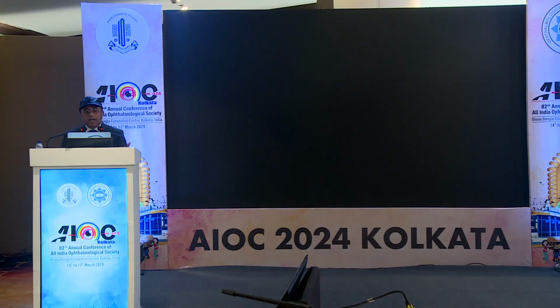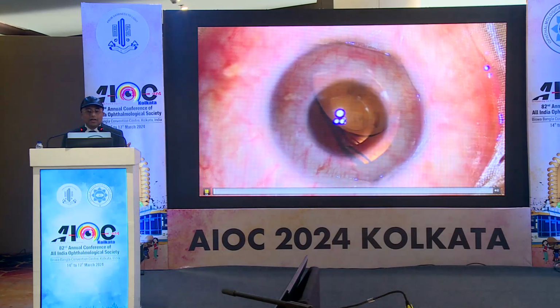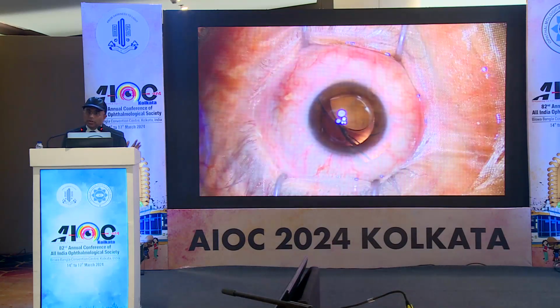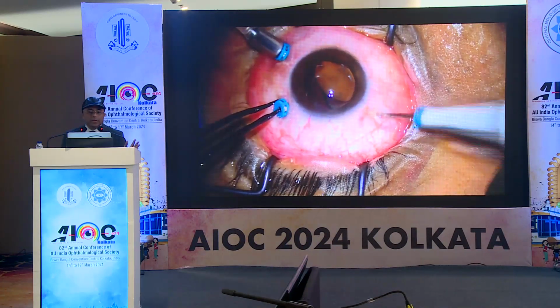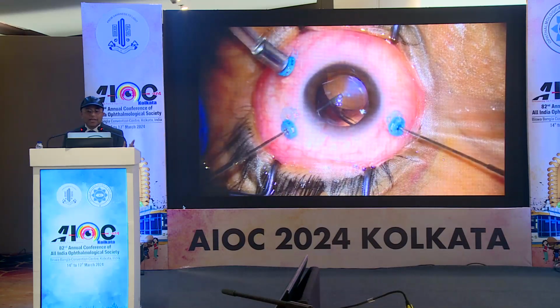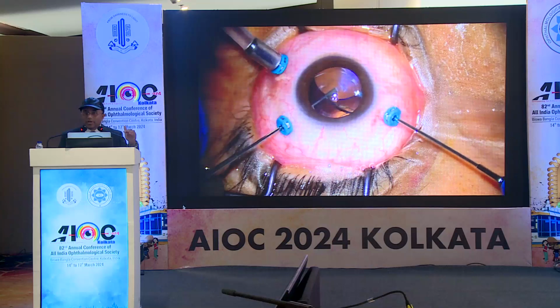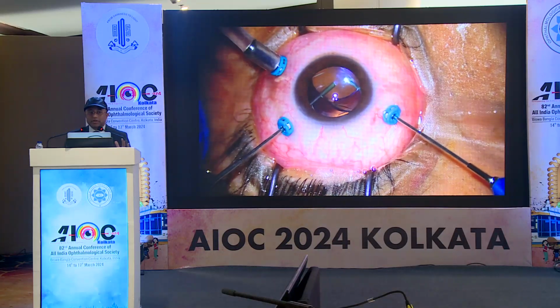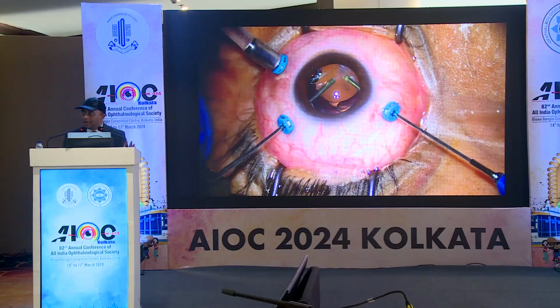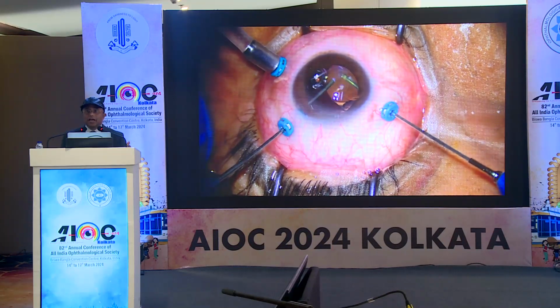Well, I'll just end with a small video. It's a very interesting case. This is about a patient whom I had operated 10 years back with Restore implanted in both eyes. In 22, he had come for a checkup, everything was fine. But last year he came with this feature. There was a spontaneous rupture of the posterior capsule 10 years after surgery. So I thought this is something really different I have never encountered.